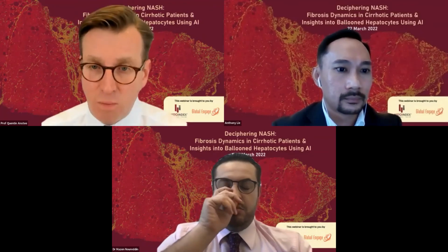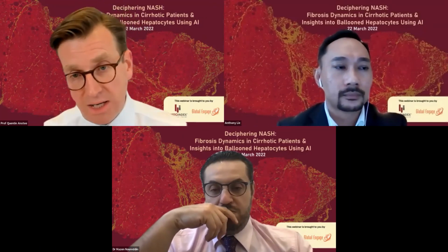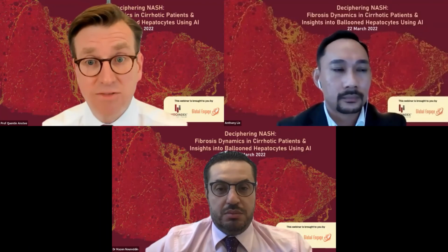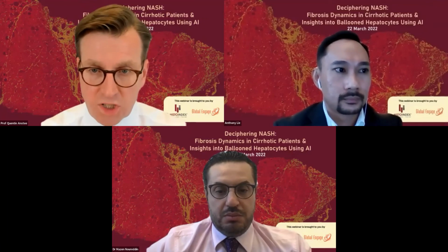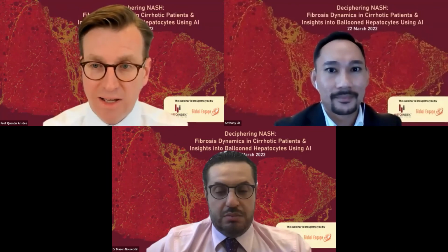So we started off with many, many more than that. We looked at a whole range of features, those specifically related to ballooning. I've mentioned also some issues related to fibrosis, because of course, the reason we are all interested in ballooning is because we believe it is relevant for fibrosis, and then we condensed it down into the Q-ballooning 2 index, which contained those specific features. If you're interested in what they actually are, they're all listed in the paper, so it's all there to have a look at.